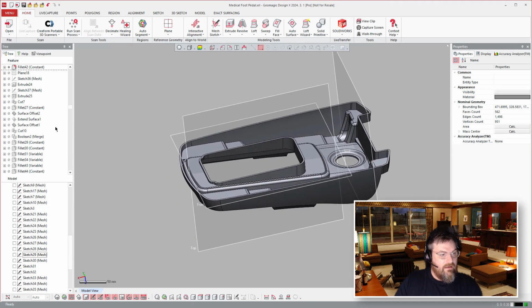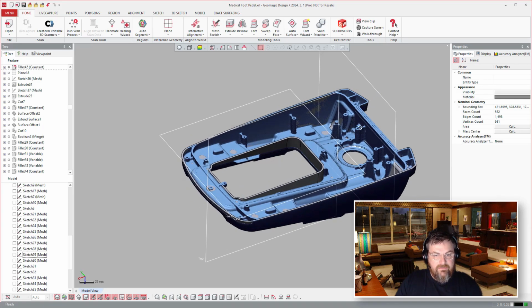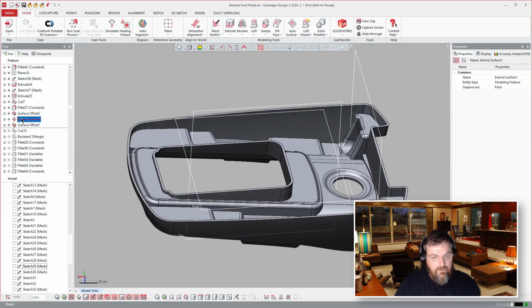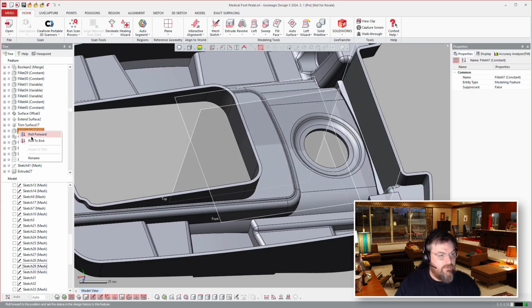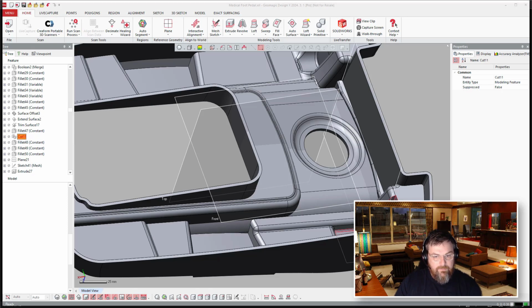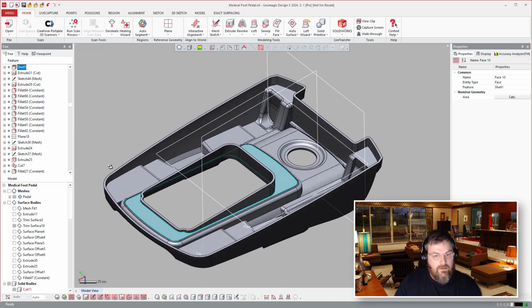And then now the process goes that we're going to go ahead and add some of these features in. We're going to do some trim work on this and then add the standoffs to the backside here. So if I come over and drop down a few more layers. So now if I just click on some of these features here, see where they are. Oh, we went ahead and did a little bit of work on that opposite side there first before doing the other stuff on this side. Now you'll see that that cut was us removing and cutting away from that opposite side of the distinct feature that's not symmetrical on the other side. So you see that there.